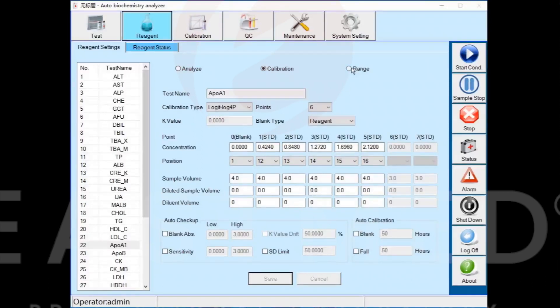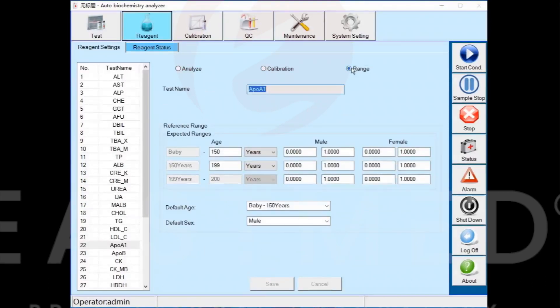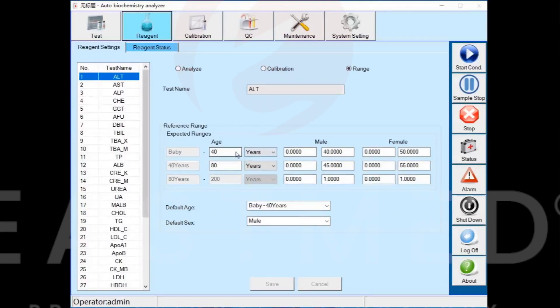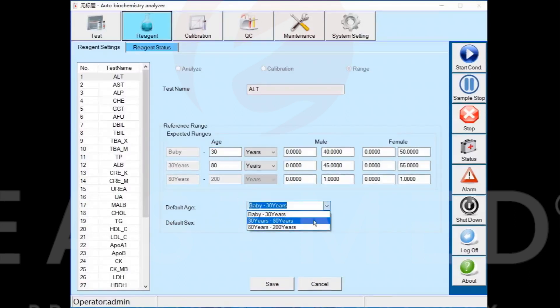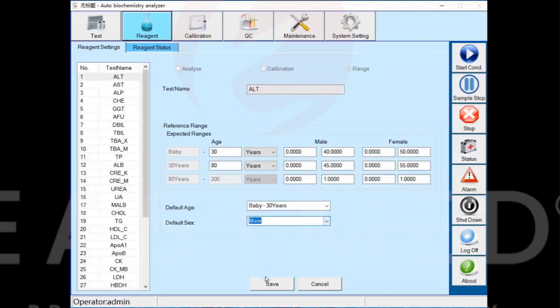In the range interface, input the reference range. You can edit different range references according to different age groups and gender. If you don't input sample age and gender information in sample information, select the system default reference range and gender, then click the save button to save.